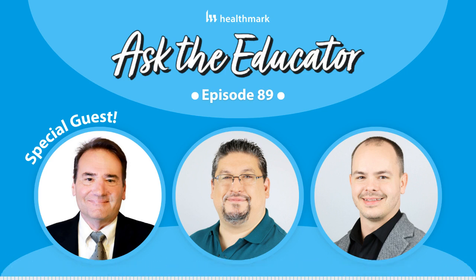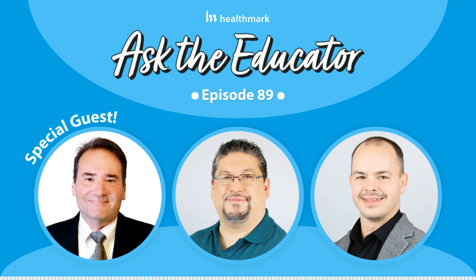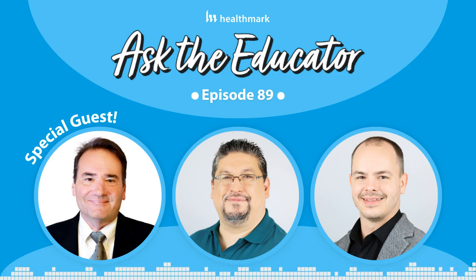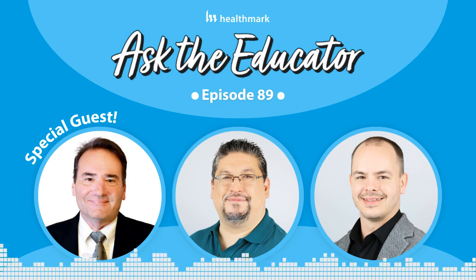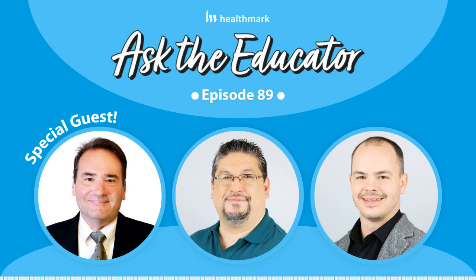Now, the goal, of course, is that a healthcare facility is capable of producing clean instruments, medical devices that are ready to go on to that next step of processing. When we're talking about critical and semi-critical devices, the follow-up processes would be sterilization or high-level disinfection. If we're talking about non-critical devices, those that come in contact with intact skin or might not even touch the patient, then cleaning and low-level disinfection might be the last step in the process. But either way, no matter what the classification of the device, you need to demonstrate that the instructions you're providing actually do result in a clean device ready for the next step in the process.